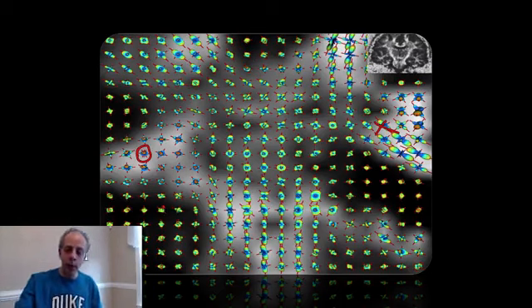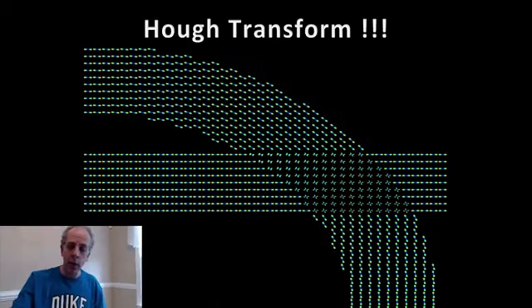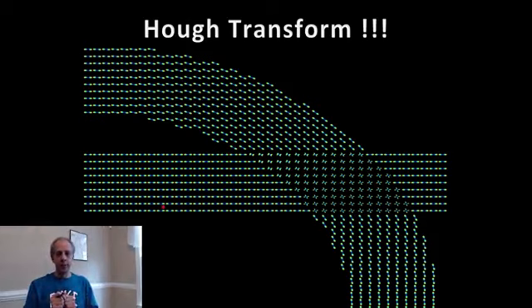And look what we can do. There are many things that we can do, but here is one of them. We can do a Hough transform. Now, we learned about the Hough transform to detect straight lines or curves. Now we are actually going to do a Hough transform for something slightly different, but these are still curves. We want to find basically cables in 3 dimensions. So this is how we do it.